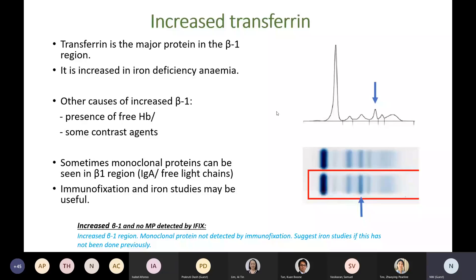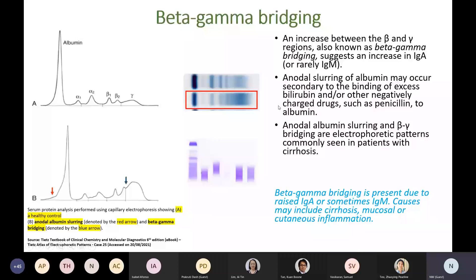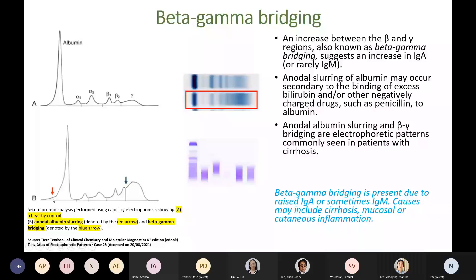An increase between the beta and gamma regions, also known as beta-gamma bridging, usually suggests an increase in IgA and rarely IgM — as shown where beta and gamma cannot be clearly demarcated. Anodal slurring of albumin may occur secondary to binding of excess bilirubin or rarely other negatively charged drugs such as penicillin to albumin. Beta-gamma bridging and anodal albumin slurring are electrophoretic patterns commonly seen in patients with cirrhosis. If you see this pattern, it is useful to look at liver function tests rather than just blindly commenting on cirrhosis.